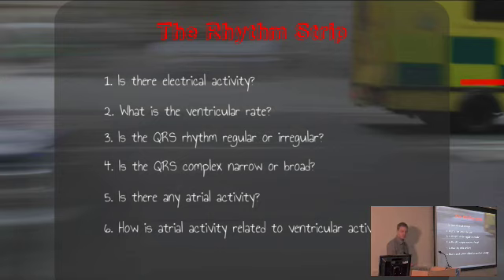Okay, so once we've worked out the rate, we want to know, is it regular or irregular? If it's regular, it's obvious. If it's irregular, there's another question we want to know, what's that?